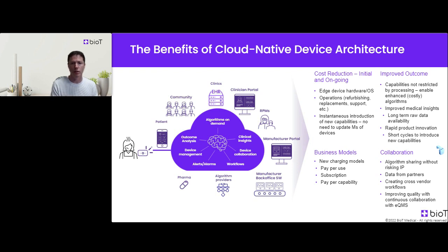But actually, more can be done, because when you have this camera looking down, you can also execute a urine algorithm on that. And when you have this architecture with the raw data, you can send the raw data of the picture to a third party with that urine algorithm. And then with the same hardware, you get much more functionality.